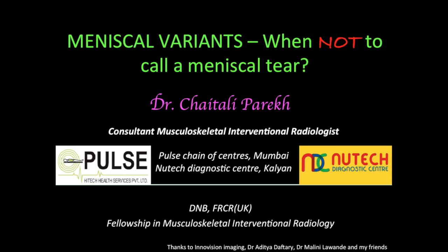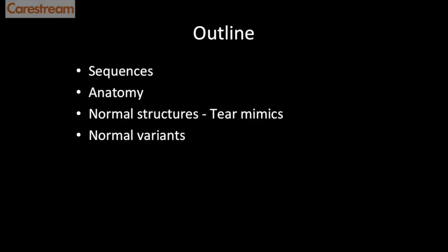Today we'll be discussing meniscal variants — that is, when not to call a meniscal tear. We won't be concentrating on sequences, and as far as anatomy goes we'll only discuss meniscal anatomy. For those interested in sequences and MRI knee joint anatomy in detail, you can go to the MRI knee joint anatomy video on the Indian Radiologist YouTube channel. After that we'll discuss normal structures that look like a tear — that is, tear mimics — and finally we'll look at normal meniscal variants.